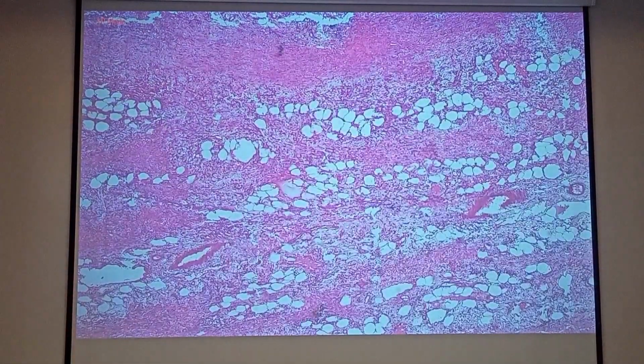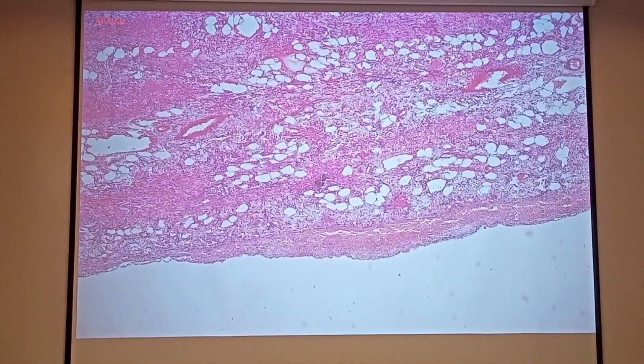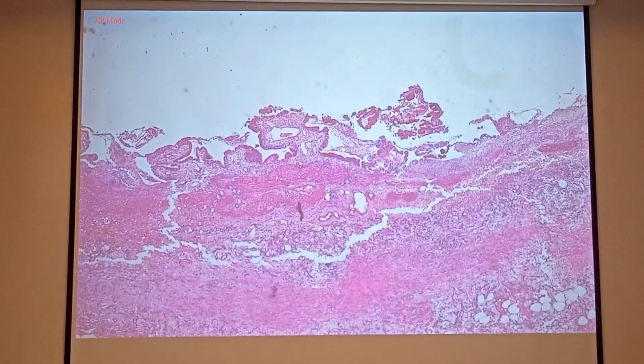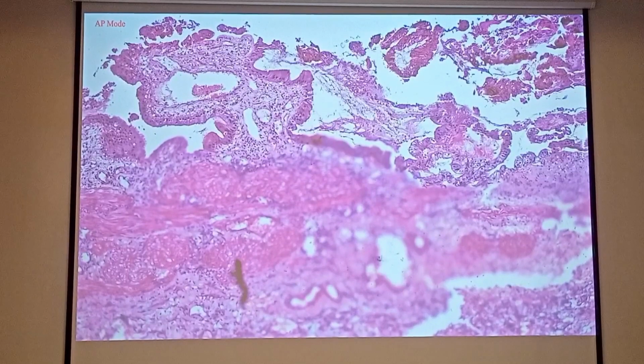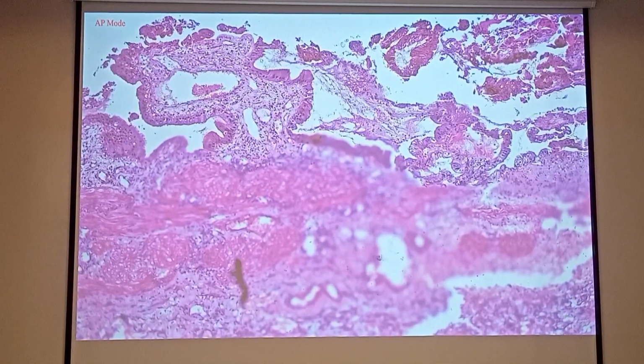The first thing you're going to do is identify the tissue. By this alone, I cannot identify it, but there's something in here. What do you think that is? This tissue is apparently lined by, let's look closer. What kind of epithelium is that? Simple columnar. Some have cilia. Not all, but some have cilia.